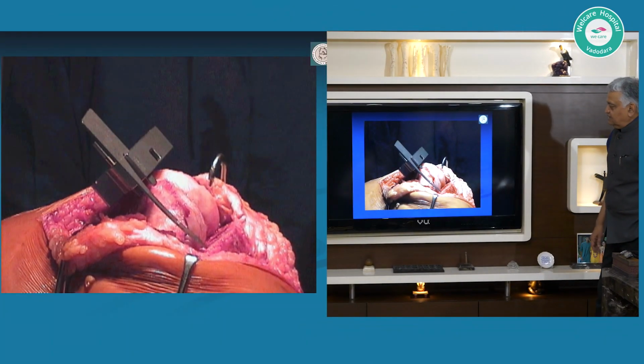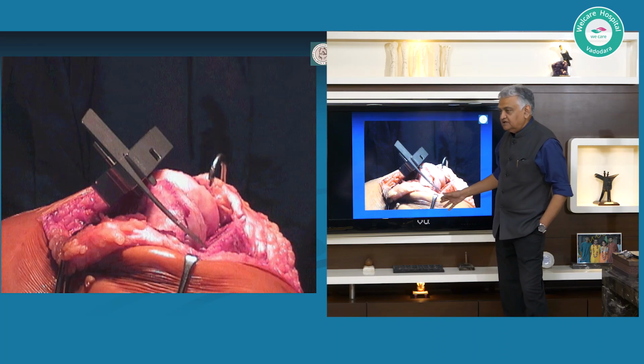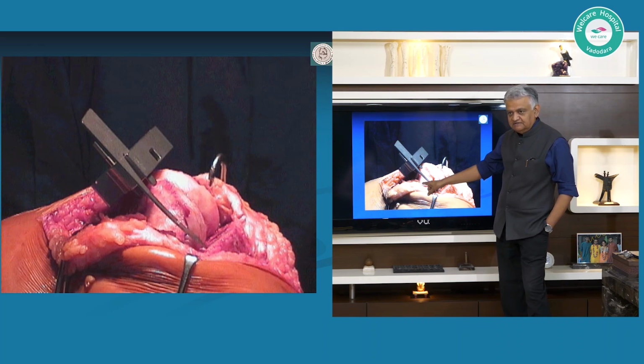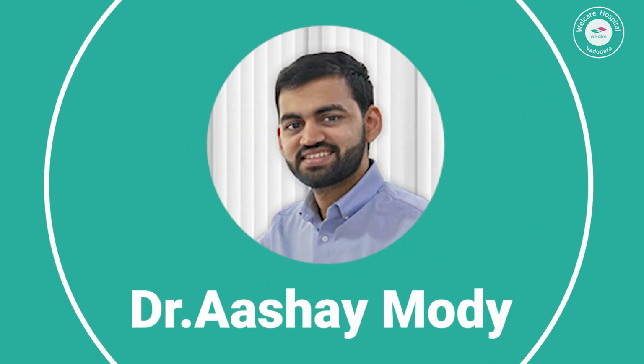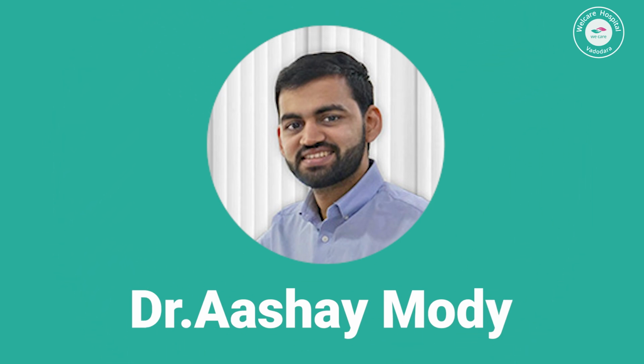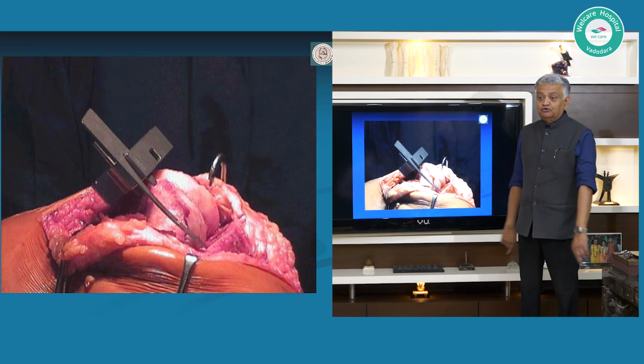Next, just before cutting with an angel wing, you are making sure, what am I checking here? That by mistake, for whatever reasons, my cut is not so deep that I am getting into the condyles, into the epicondyles. When can it happen that the angel wing shows that your cut is going to be so deep?